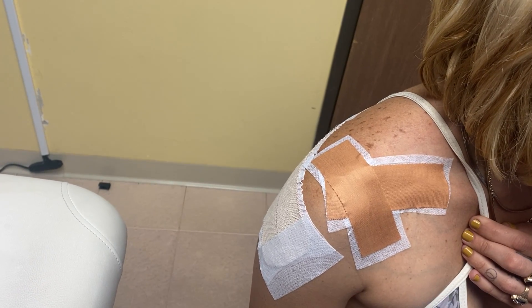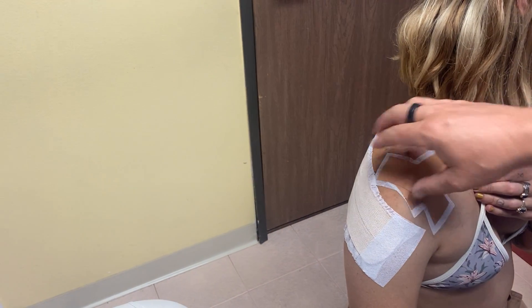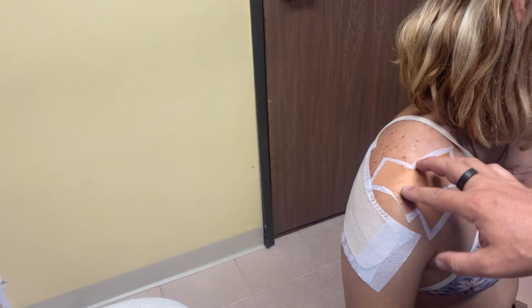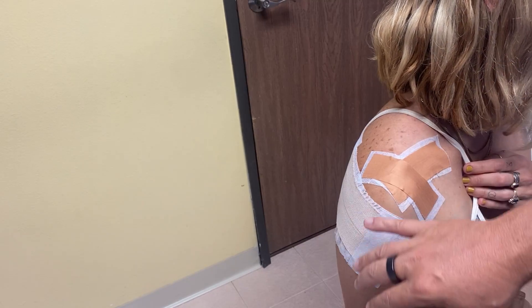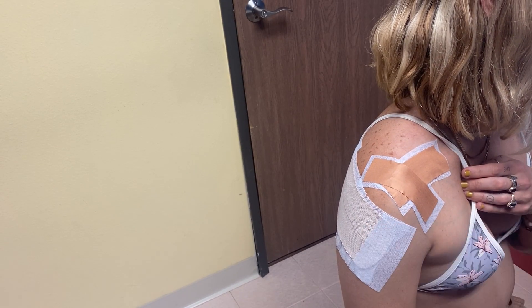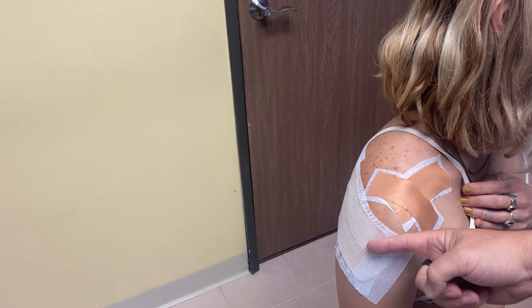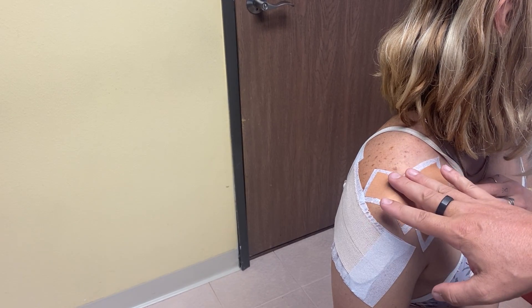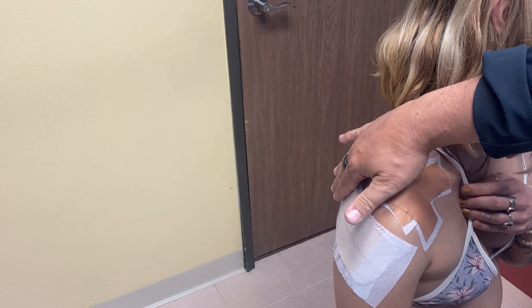There's our AC joint tape and our glenohumeral tape, which is the most common shoulder tape. We're going to see a lot of people need this post-regenerative medicine. If the AC joint is loose, unstable, or separating, we'll use this tape. If the glenohumeral joint is loose, subluxating, or unstable — maybe there's a SLAP lesion — we'll use the tape like this. What we don't do is put tape over the joint because it tends to pull the joint out of its normal position and create impingements. The tape is going to be below the spine of the scapula.